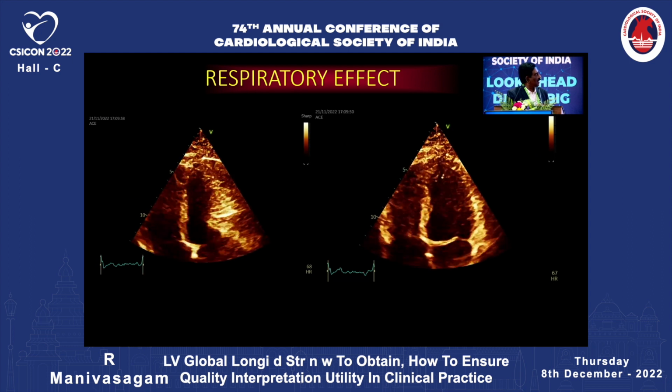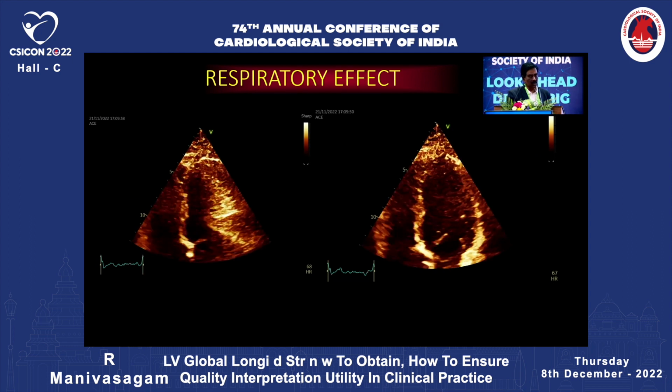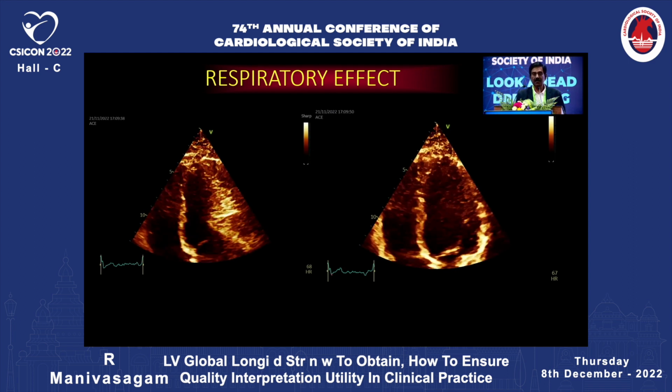Coming to the respiratory artifact, in the apical 4-chamber view, the septum is seen but not the lateral wall. You should patiently wait for the end expiration.